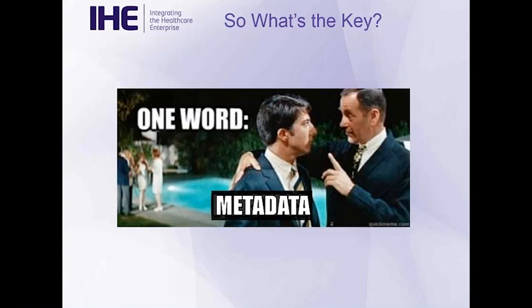That I've got a JPEG, I've got a picture, that's great, it looks like it's a patch of skin. Who's the patient? When was this taken? Why was this taken? What body part am I looking at? Who was the doctor that this is for? What department is associated with it? So unless you've got the metadata to go with that JPEG, you haven't got a medical document, you've got a set of pixels.